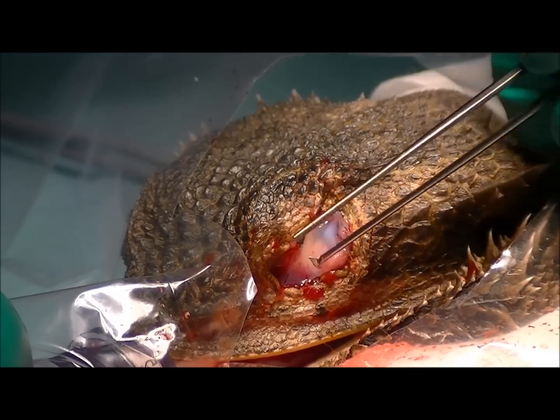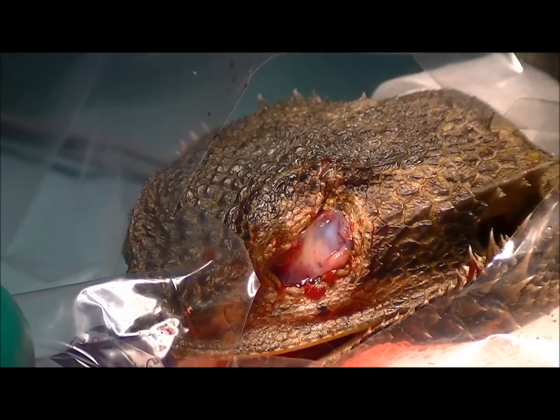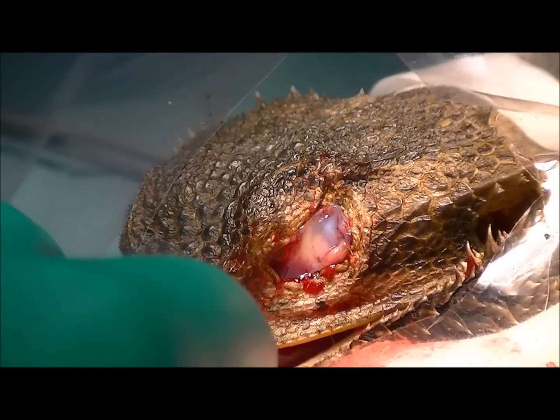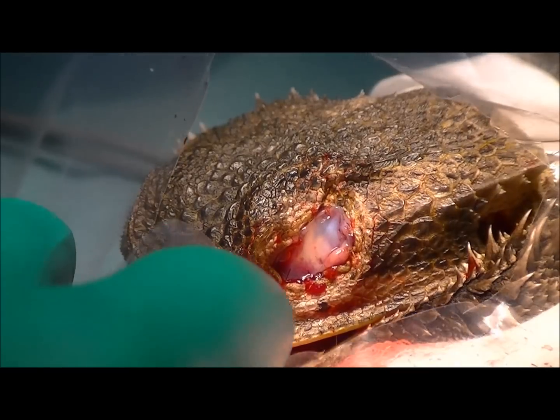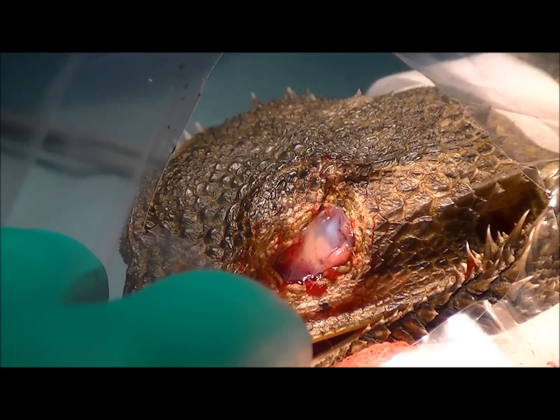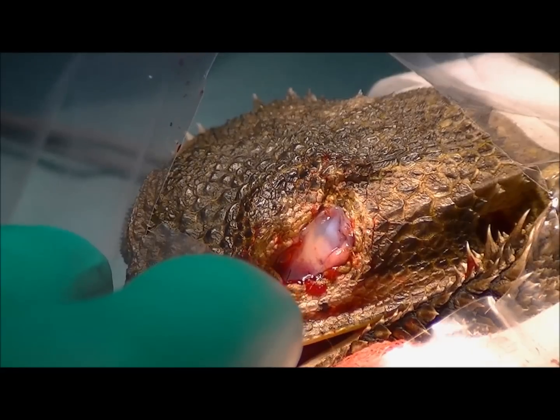All in all that surgery has gone well. We've taken out that diseased eye and she should make a full recovery. So we'll wake her up now, give her some fluids under the skin, and obviously some pain relief — she'll go home on pain relief. We'll check her again in about two weeks to make sure she's going okay, but I wouldn't expect any major complications from that surgery.